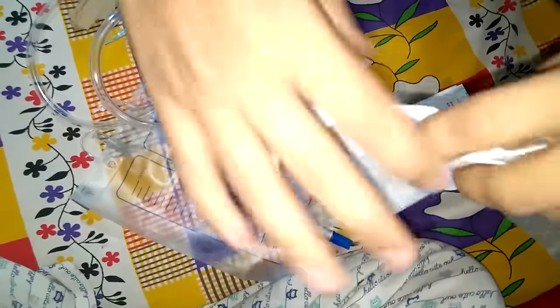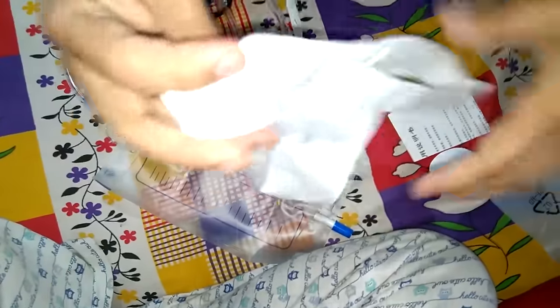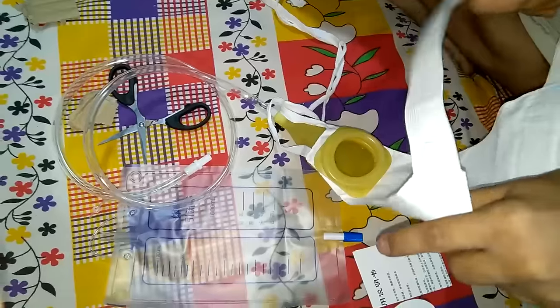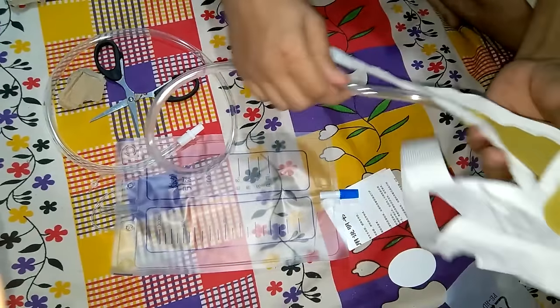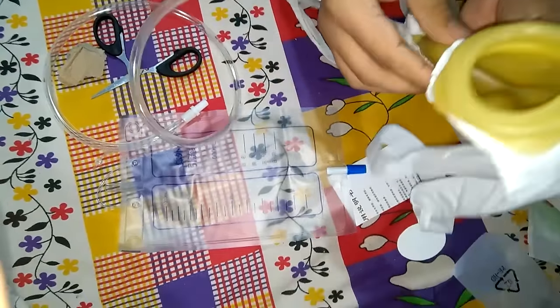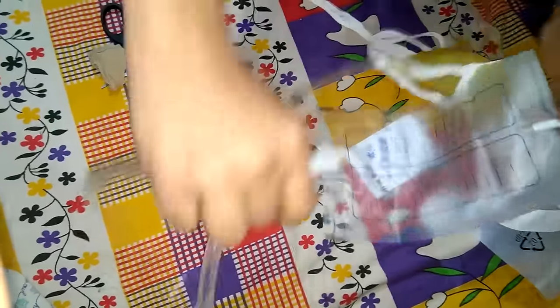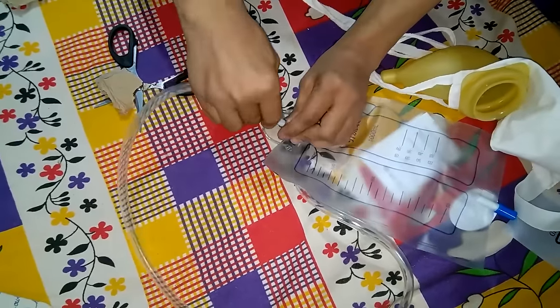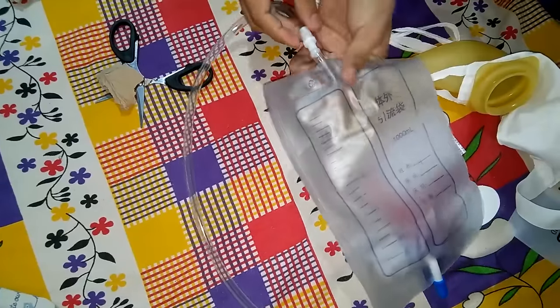This is a male one, where you can very easily get this around the male person and that person will urinate into this silicon-type rubber tube, and it will be transported back through this pipe to this polythene bag.